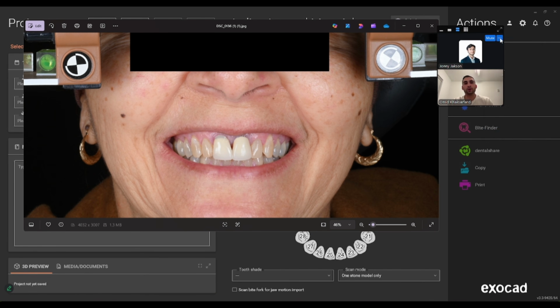After discussion, and seeing what the patient really valued, it seemed that they clearly had an aesthetic concern. They hadn't smiled for a very long time, so I immediately went ahead and took the photographs and I contacted Johnny right away. Explained to Johnny, I want to do a mock-up from second premolar to second premolar. I want to make a presentation of where she can be because as doctors, we see the vision, we understand the process, but the patients don't really understand what we're thinking. At the end of the day, they want to see the best results. They want to get the result they want.